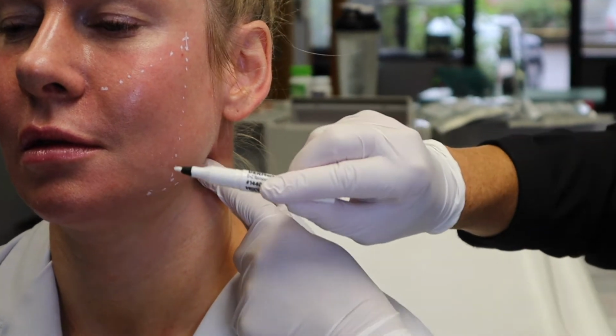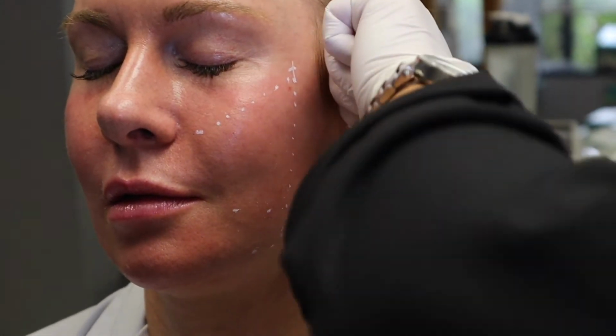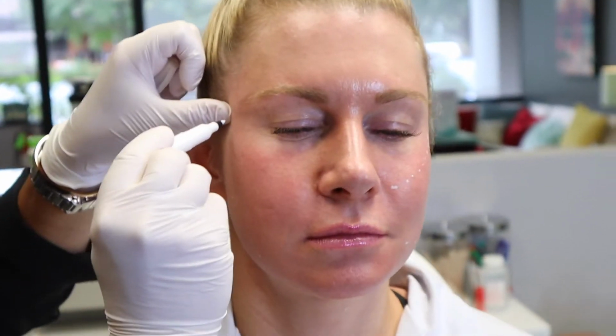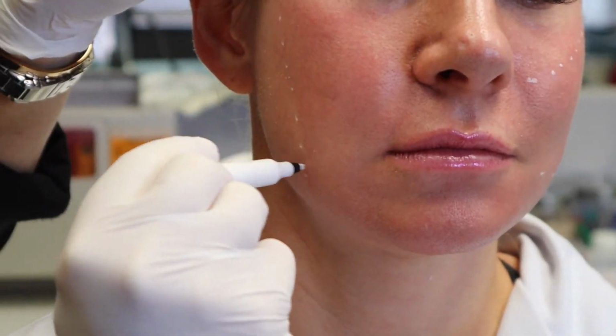This other angle is at the angle of the mandible laterally, and as we target the corner of the mouth, we can actually pull that up for a patient who might have a downward turn that is starting, or that can also be quite severe.